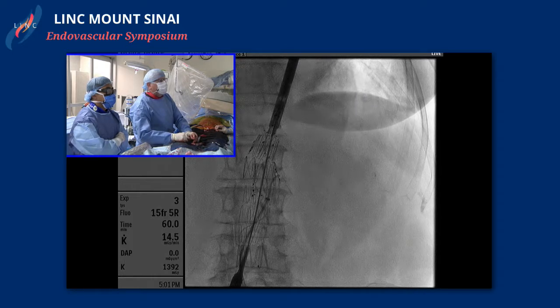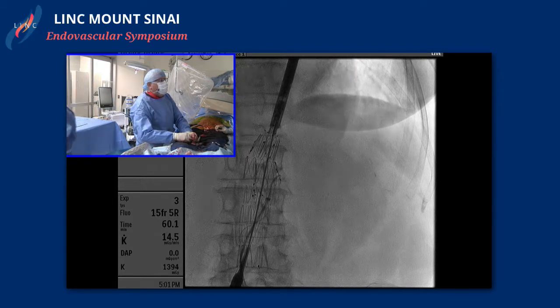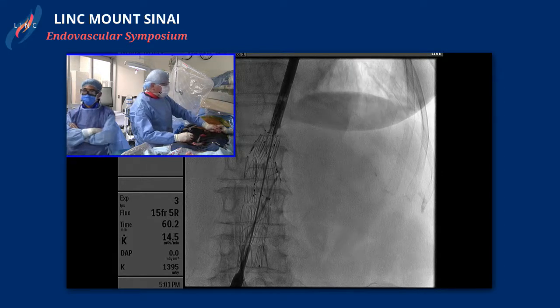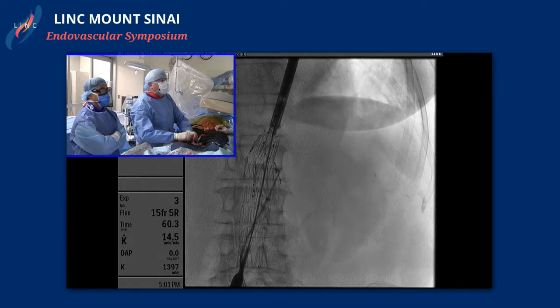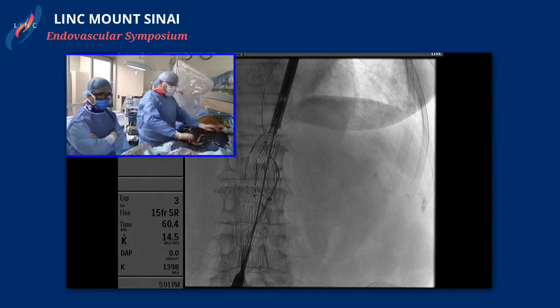What's your go-to strategy for cannulating these fenestrations? What catheters and wires do you typically use? It depends on the angle. Right now I'm trying to just get something out in there. I just got this out and I'm going to go to a Sos VS2 to try and use that to shape and get in — I'll form it and then pull it down — because this isn't really going in with what I've got right now. So give me a Sos. We'll take this one out.